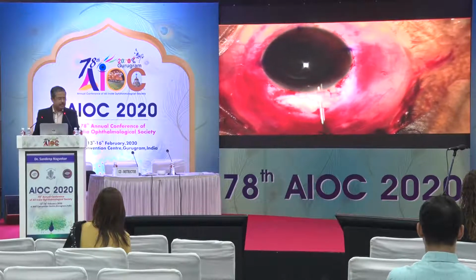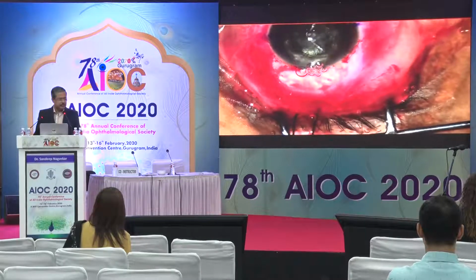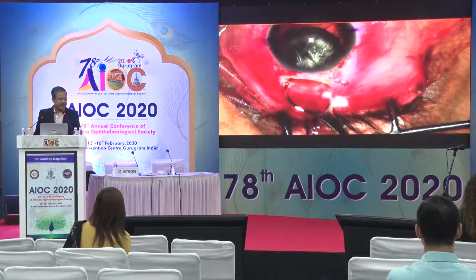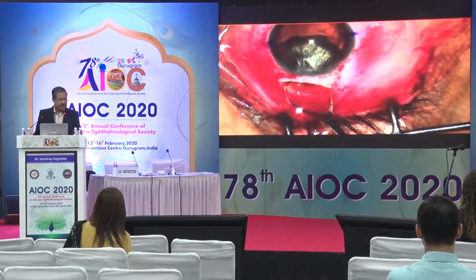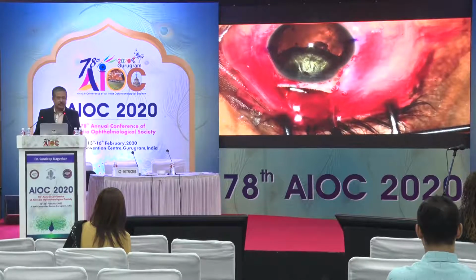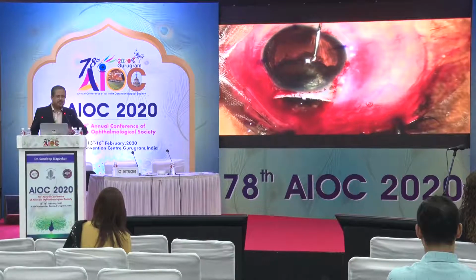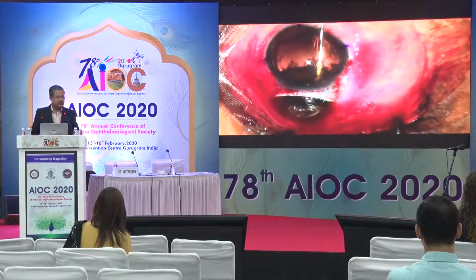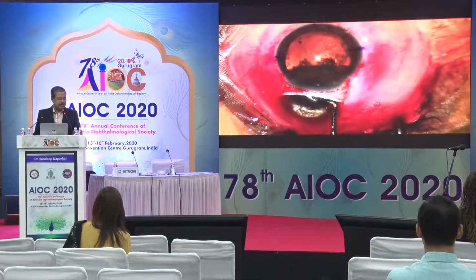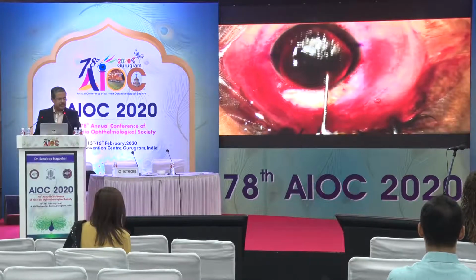Once the lens has come out of the capsular bag, I injected visco underneath the lens. That ensured that I was going to do a visco expression, using a vectis to engage the nucleus in the wound, but the nucleus was very large. It wasn't coming out, and of course then at that time, I remembered those gynecologists who used to have those difficult deliveries, and they used to thump on the fundus of the uterus from the back. So here you can see I can go from the side port and push that nucleus into the wound. Once it is into the wound, using the same 26 gauge needle that was used for the capsular rhexis, I got that entire nucleus out.